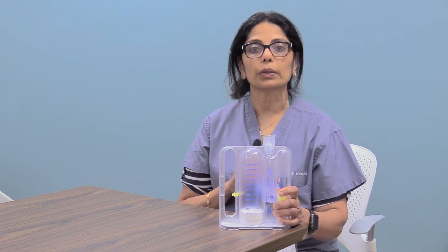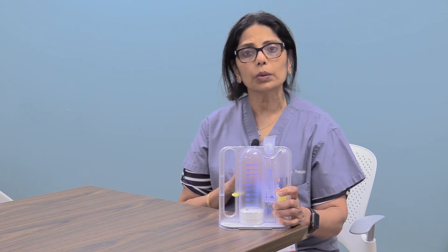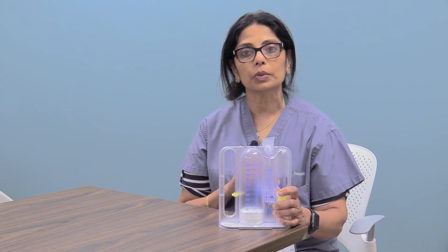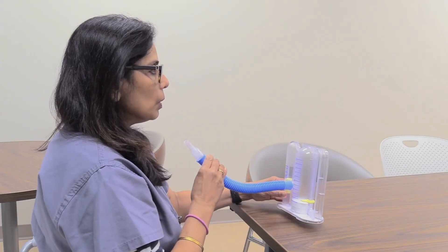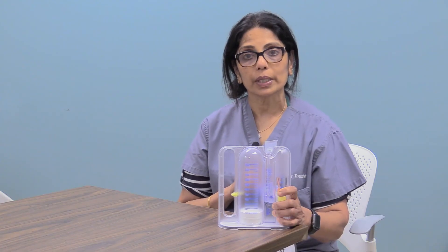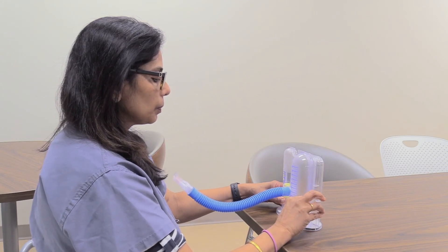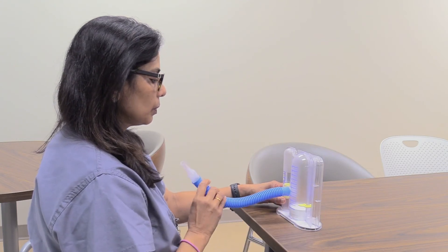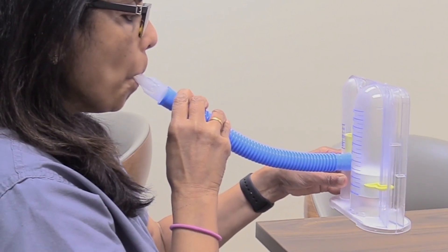Make sure while you're inhaling the flow indicator is hovering in the best position. While you're holding your breath, the piston will drop to the base of the incentive spirometer. Exhale slowly through your mouth. If you're feeling dizzy or short of breath, rest until you feel better. Pay attention to what number the piston rises to.